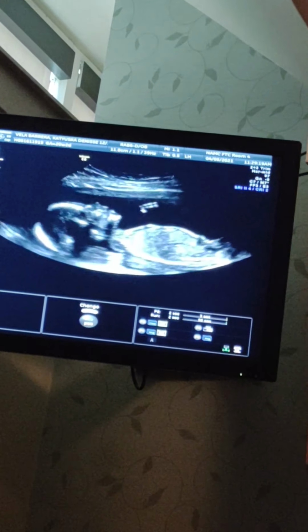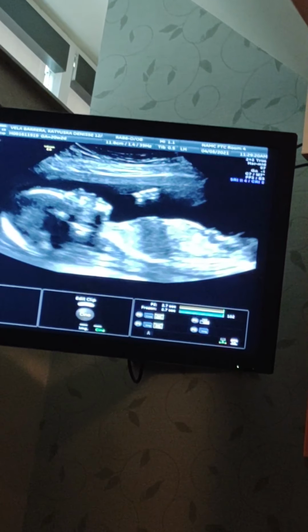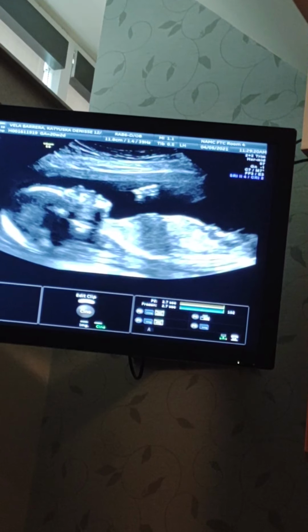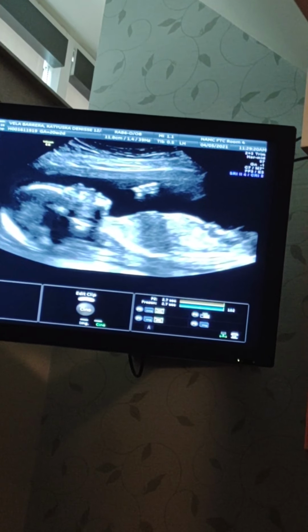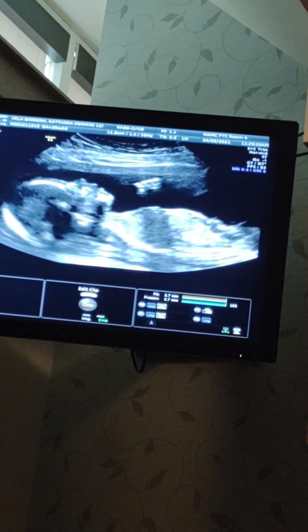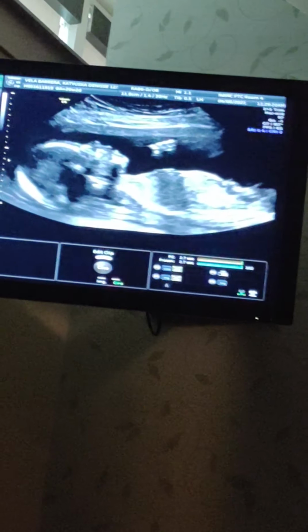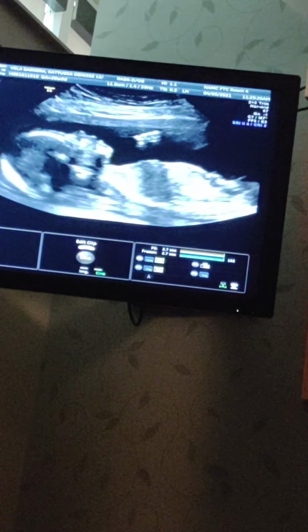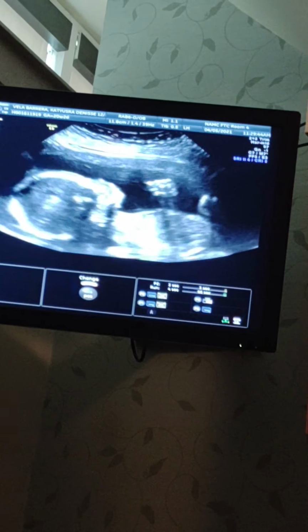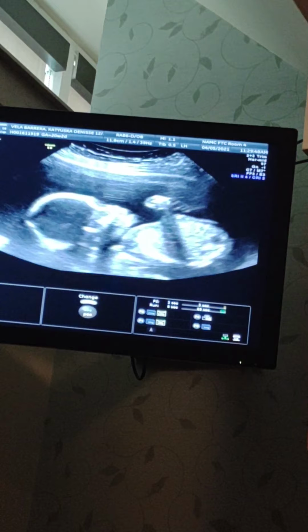At 20 weeks, at this stage, I kind of like this type better. To look at the baby. Like baby's laying on its back there. Hand is up going towards the mouth. In profile. Is that a picture? The baby is not moving. No, it's a frozen picture. Okay. See, here comes the hand. See the hand move? Both hands are going up by the face there.